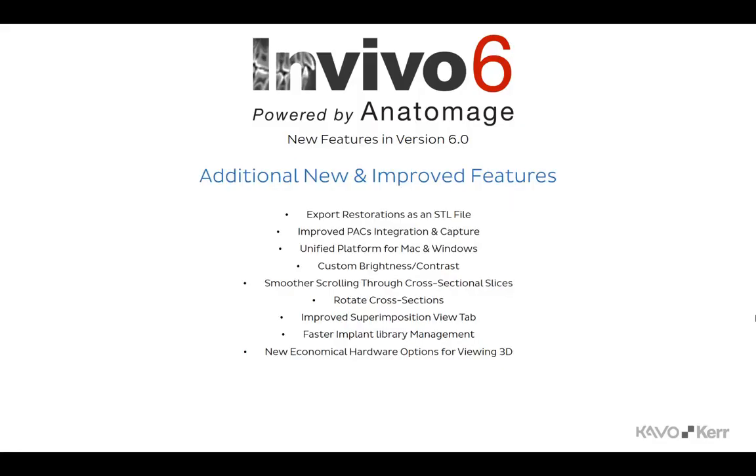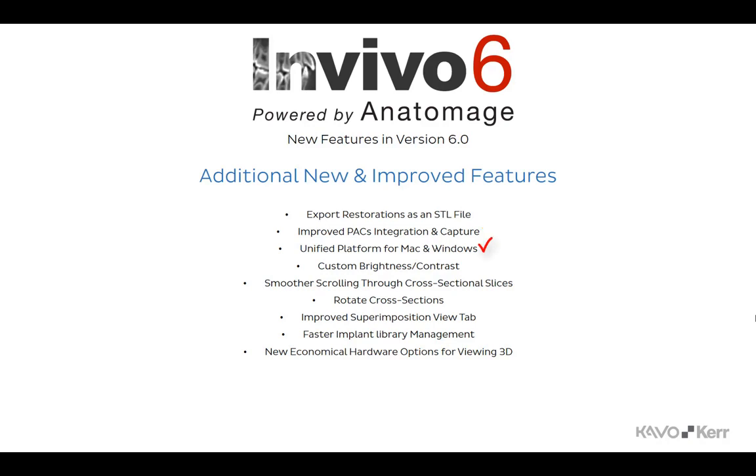Additional to the new features you have just seen, Invivo offers more new and improved features. The software now allows for the export of restorations as an STL file. There is an improved PACS integration and easier capture file saving functions.